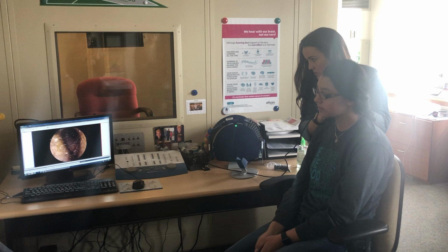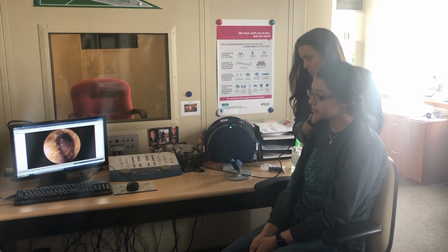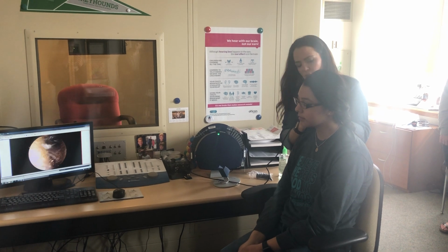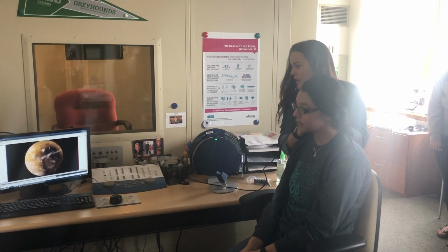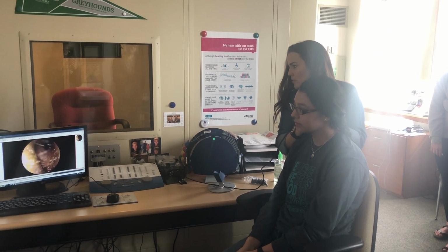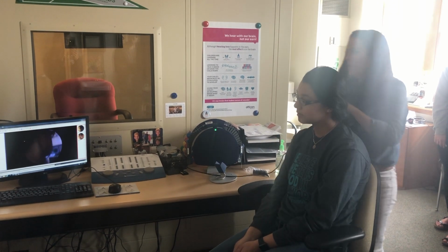and make sure you're bridging. But you could see she has tiny little ear canals. Her ear canal's clear, and then all the way in the back I could see the eardrum kind of shining back. And then I can actually take a picture and store it in the file for the patient.